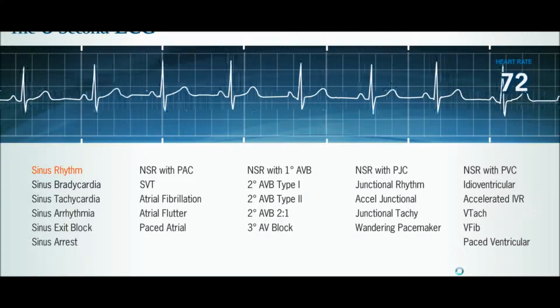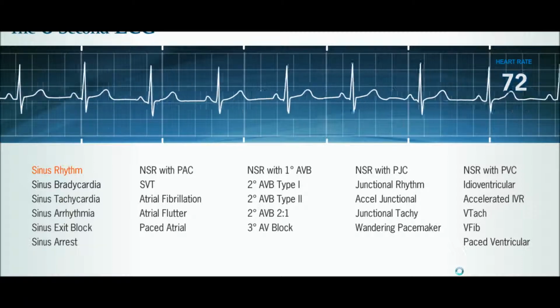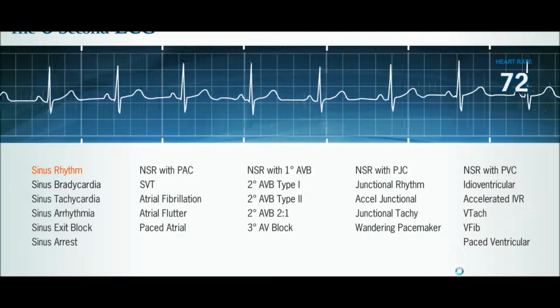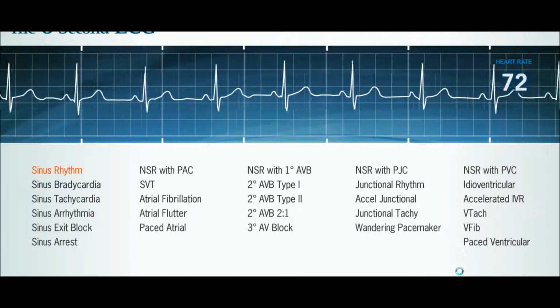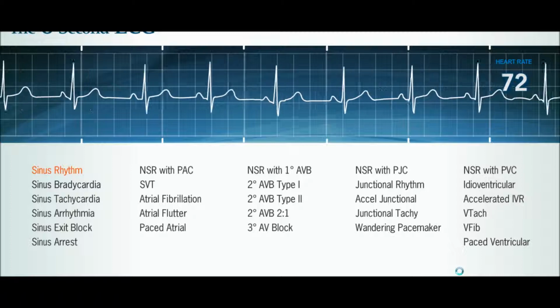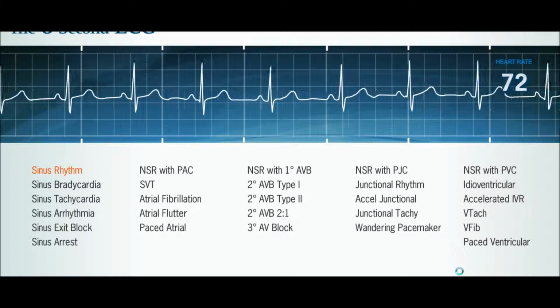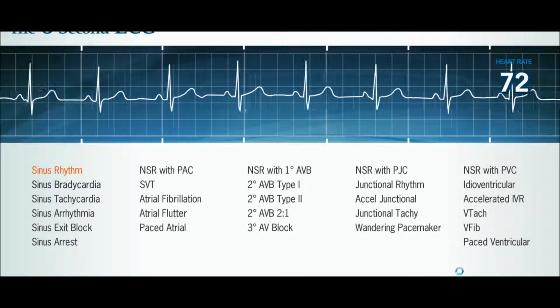Alright YouTube, welcome back to another one of my cardiology videos about the heart. And this is a second video after my first video where we went over the basic electrophysiology of the heart. And I said I was going to get around to doing some videos where we talked about different rhythms that the heart can display and how those would be interpreted, and so that's what we're going to do today. I apologize it's taken so long.